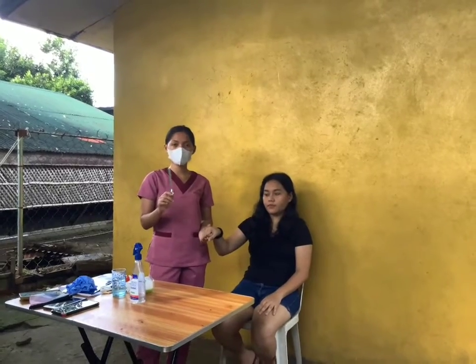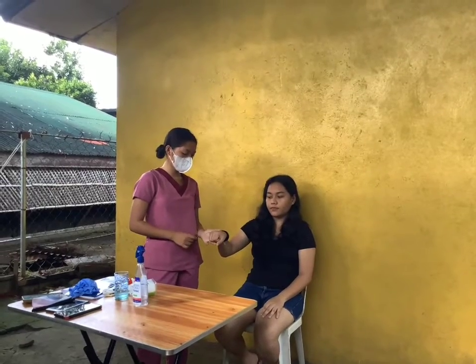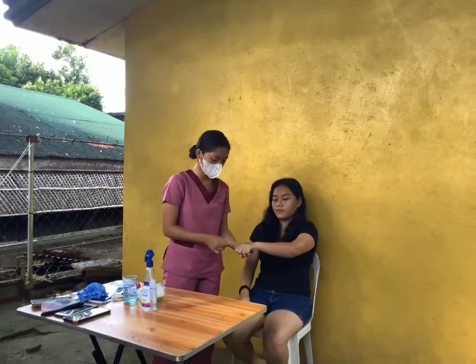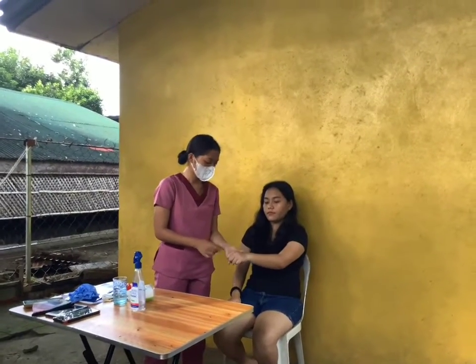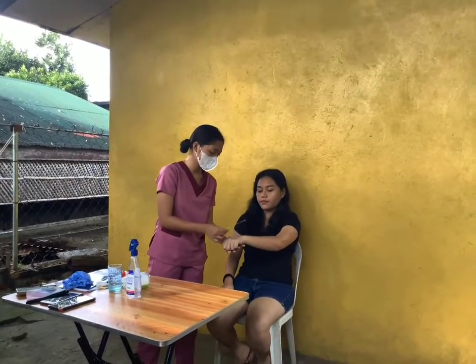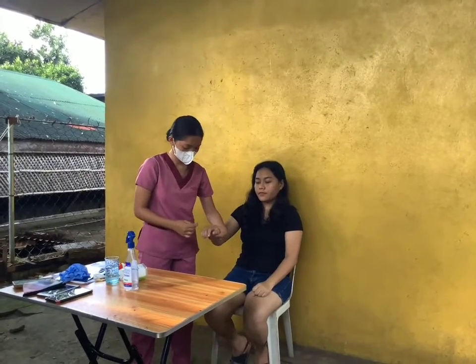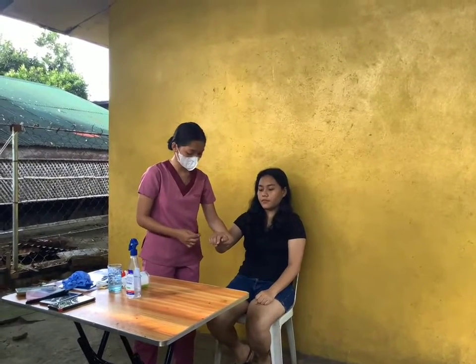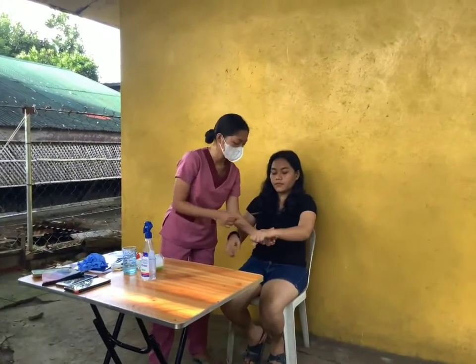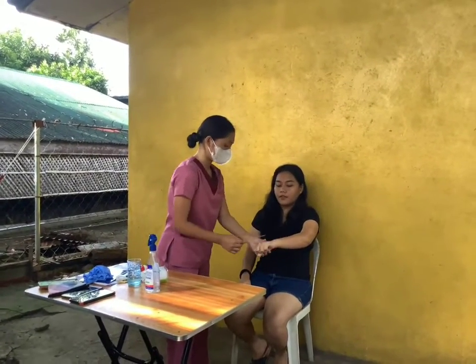Vibration. Test vibratory sense on each side using a 128 Hz or 256 Hz tuning fork by placing the vibrating fork on the bony prominence of a finger or toe. Ask the patient to tell what he feels. He should report this sensation as a vibration. Then ask patient to tell you when the vibration is not felt anymore. If there is impaired vibratory sense, test a more proximal bony prominence. With aging, vibratory sense may be diminished or lost in the feet and ankles. Feel ka vibration na. Nawala na.